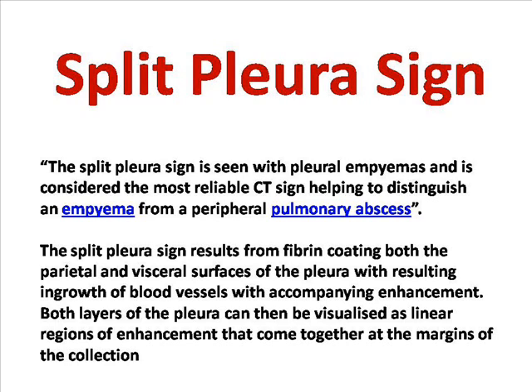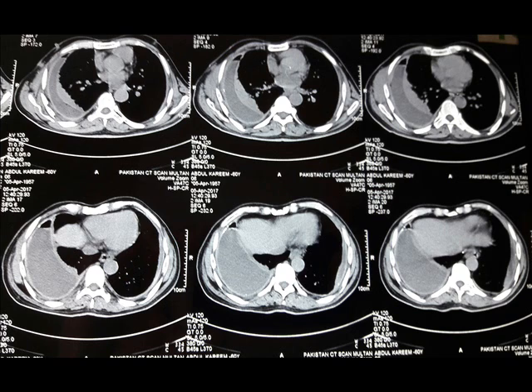The Split Pleural Sign is seen with pleural empyemas and is considered the most reliable CT sign helping to distinguish an empyema from a peripheral pulmonary abscess. This sign is very important to distinguish between these two conditions.